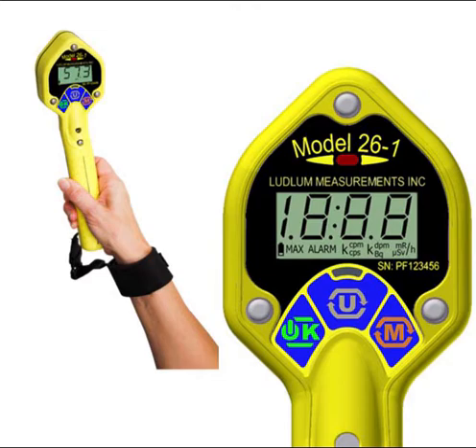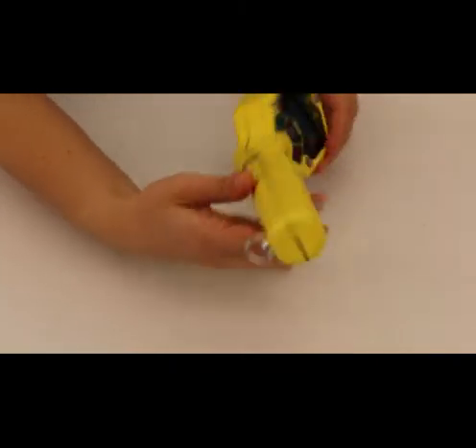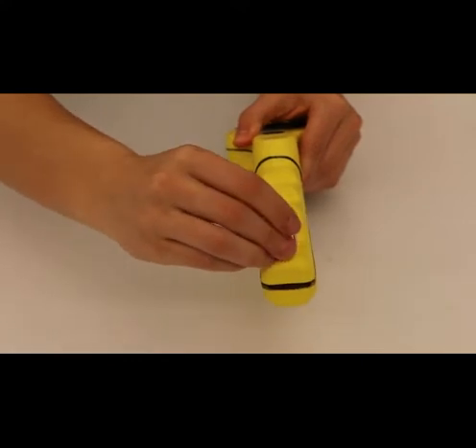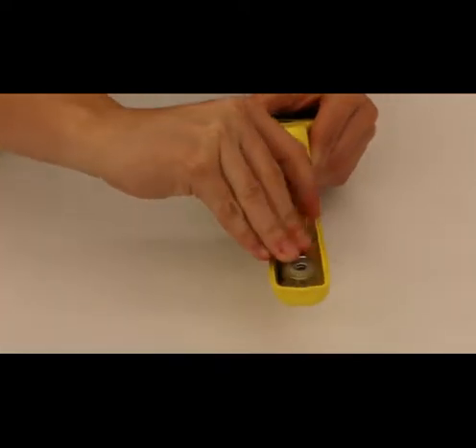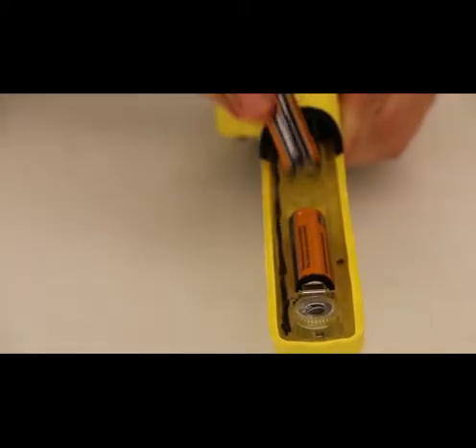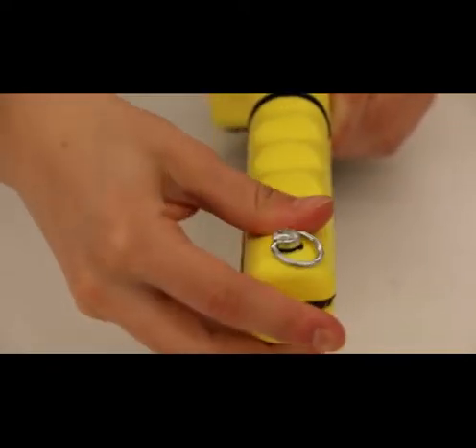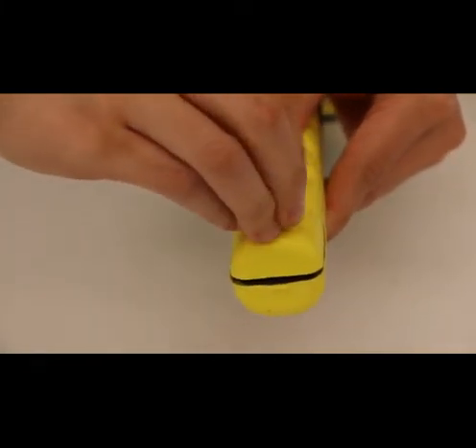The instrument is powered by two AA batteries. To change the batteries, grab the ring on the screw and turn the ring one quarter turn counter-clockwise. Release and remove the battery cover, then replace the two AA batteries. Replace the cover and turn the ring one quarter turn clockwise to secure. Caution: be sure the barb on the cover is inserted correctly into the body of the 26-1, or it may break off.